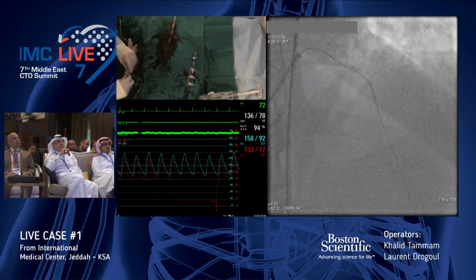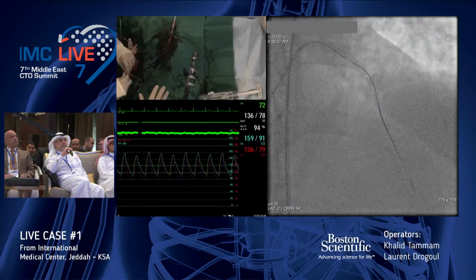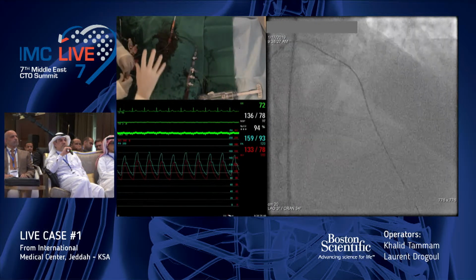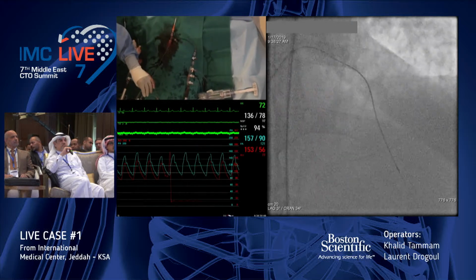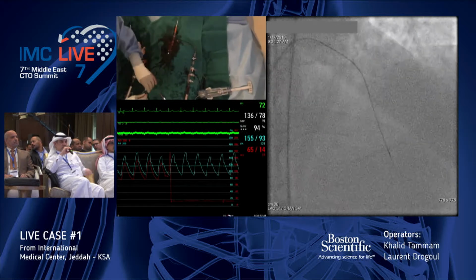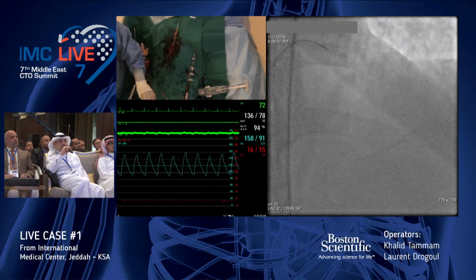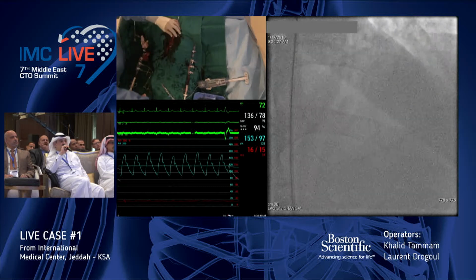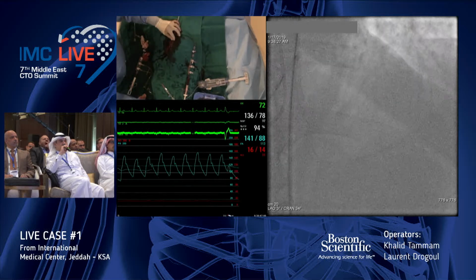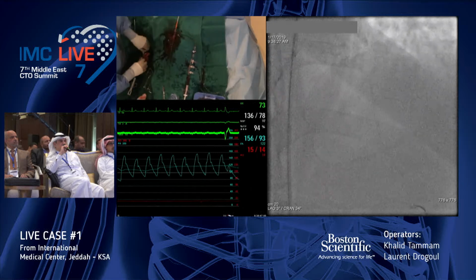And one point is very important, as you can see, we have a device inside the guiding catheter. Trapping balloon, microcatheter, so we have to check the ACT every time because of the risk of thrombus. So actually we must have ACT about 300. Yeah, okay? Now it's 400. Yeah, it was 400, so we give him a good heparin. So we take care of all this time.